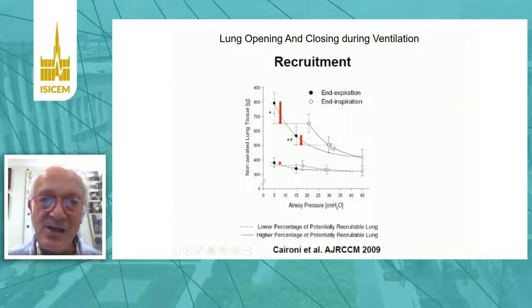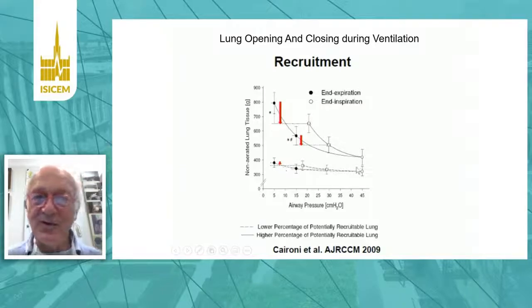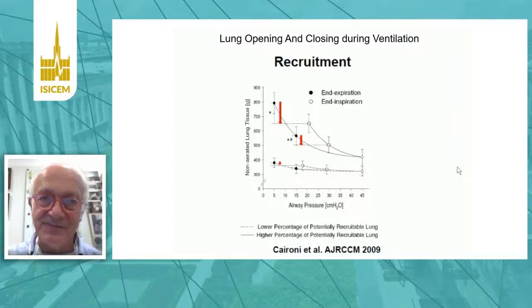expiration and inspiration. This opening and closing is supposed to be very dangerous for the lung, contributing substantially to ventilator-induced lung injury. On the bottom, you have a non-recruiter patient in which PEEP does not affect substantially the opening and closing between end expiration and end inspiration.